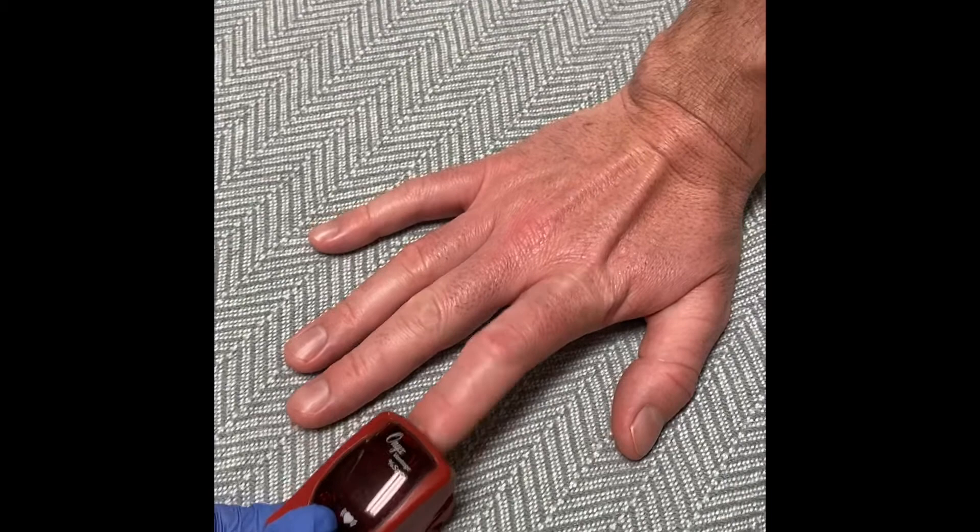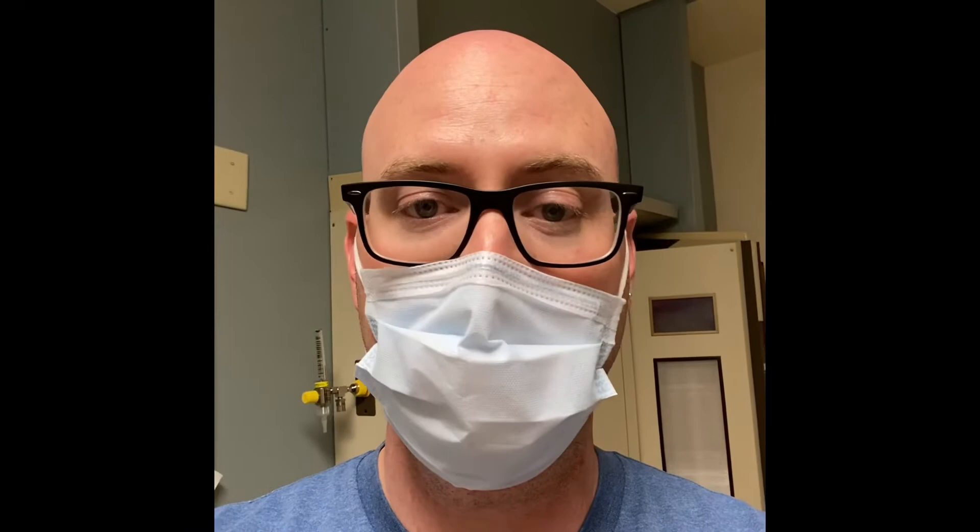After approximately five minutes of the patient getting the treatment, go ahead and stop the treatment and get another set of vitals. Last but not least, you'll want to make sure you do all your documentation in the flow sheets. And don't forget to place your nebulizer and equipment back. That's the basics on giving a breathing treatment — if you need any help, don't be afraid to call your respiratory therapist.